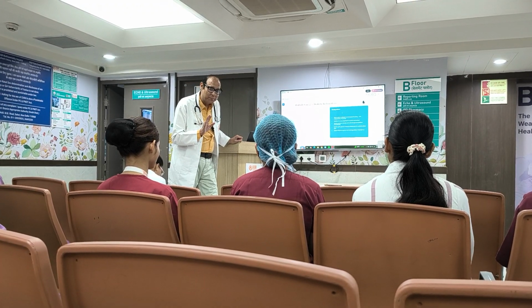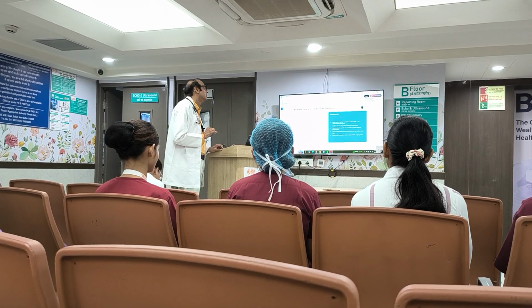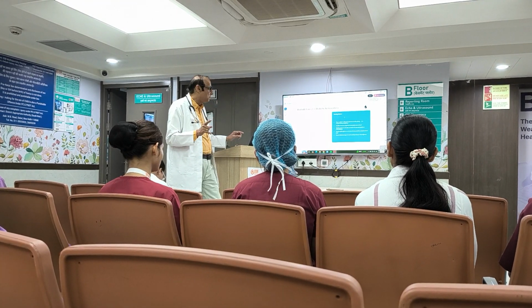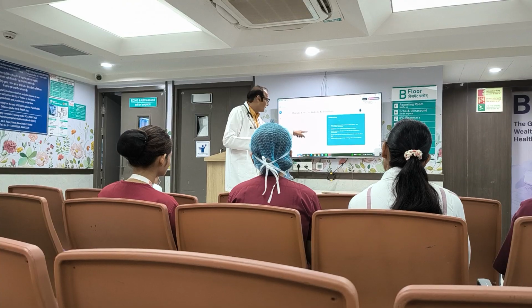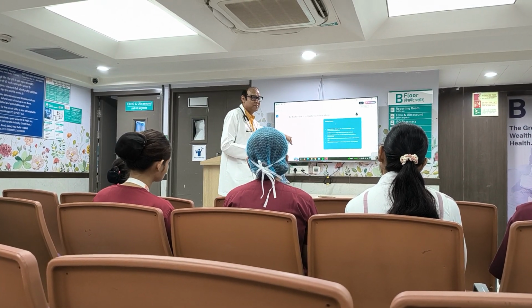एसिडोसिस रेस्पिरेटरी है, मेटाबॉलिक है, रेस्पिरेटरी एसिडोसिस है? मेटाबॉलिक एसिडोसिस है. सो इंटरप्रिटेशन में मेटाबॉलिक एसिडोसिस विद रेस्पिरेटरी कंपनसेशन, द डीप ब्रीदिंग कंपनसेशन, बिकॉज ब्रीदिंग इज वेरी फास्ट, इसलिए ये PCO2 देखो कम है, वॉश कर रहा है वो, ताकि कंपनसेशन के लिए आ रहा है, बट in spite of compensation, patient not fully compensated.